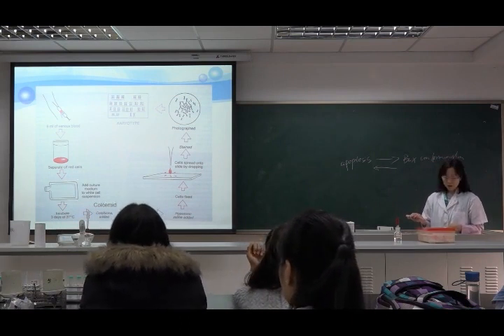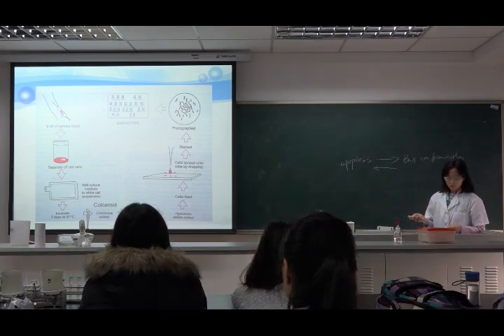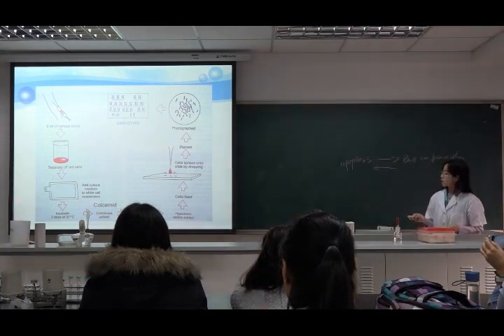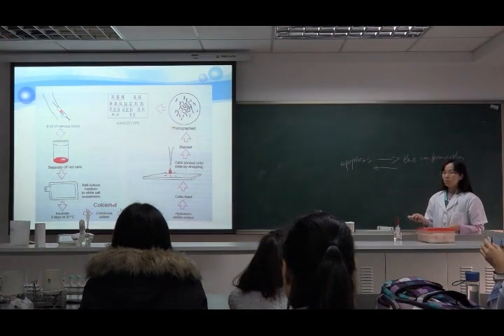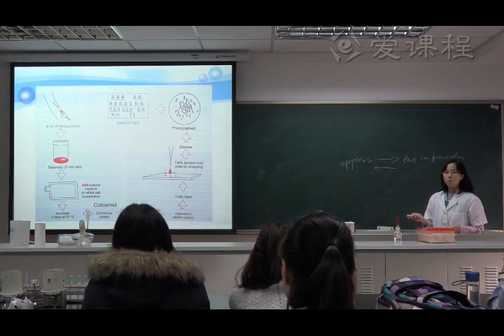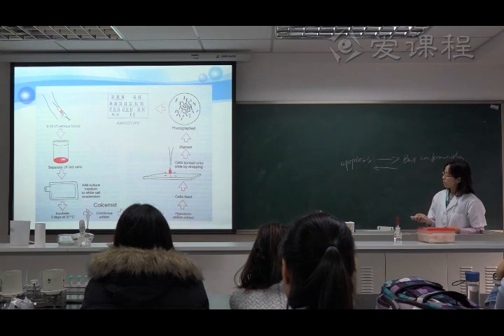And we add culture medium to the white cell suspension and incubate for 3 days at 37 centigrade. And maybe during this procedure we need to add some factors to stimulate white cell proliferation, and then it is the same as our last week's experiment.